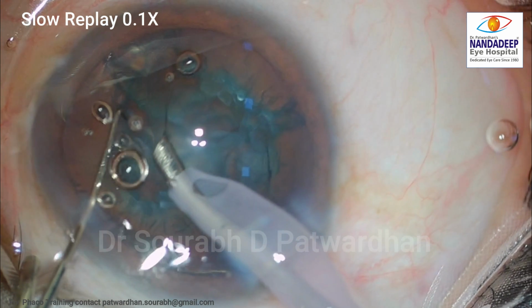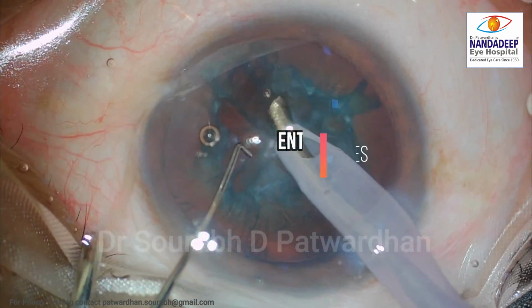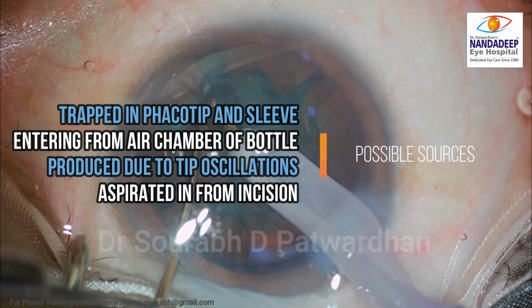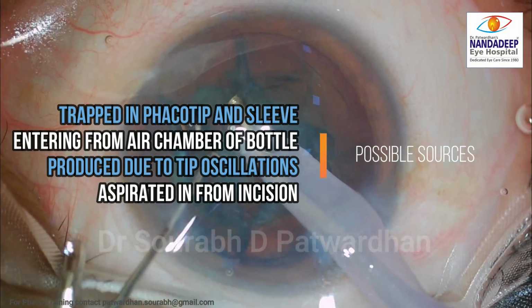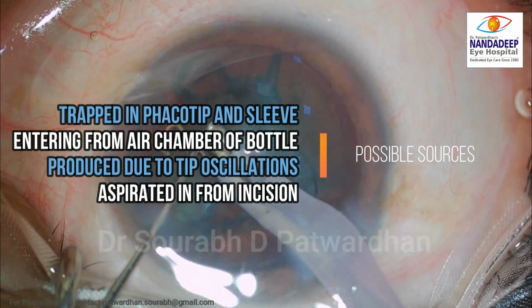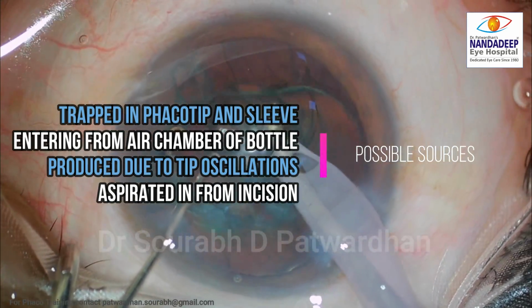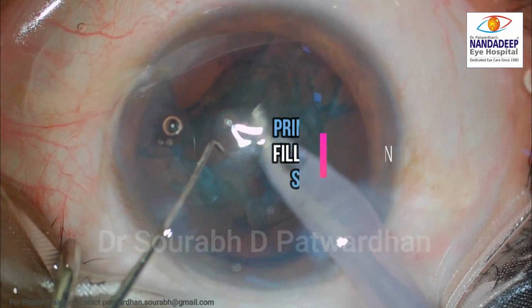So these are disturbing bubbles, though they don't affect the surgery, but we may have to again replenish visco in the anterior chamber. The most probable cause is air entering from the air chamber of the bottle, though a few other things can be there, like air trapped in the phaco tip or sleeve. Oscillations and aspiration from the side incision can also occur occasionally.